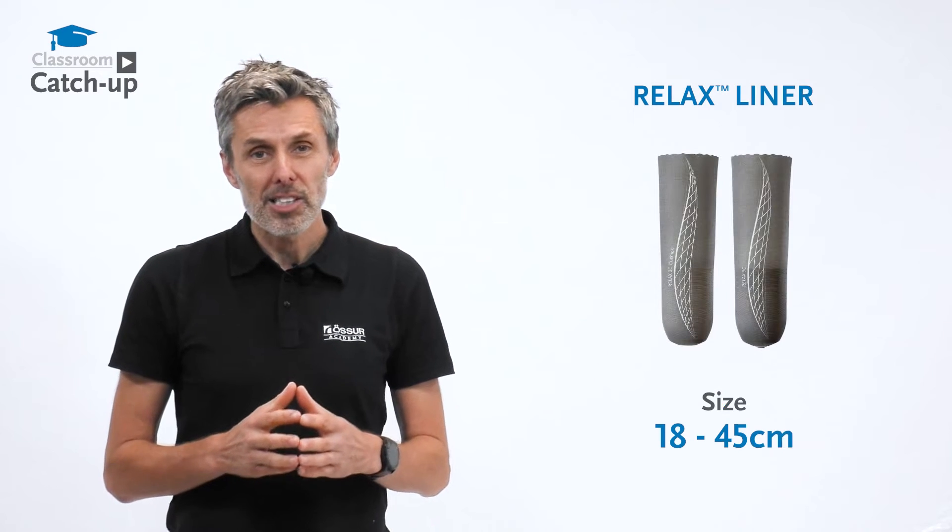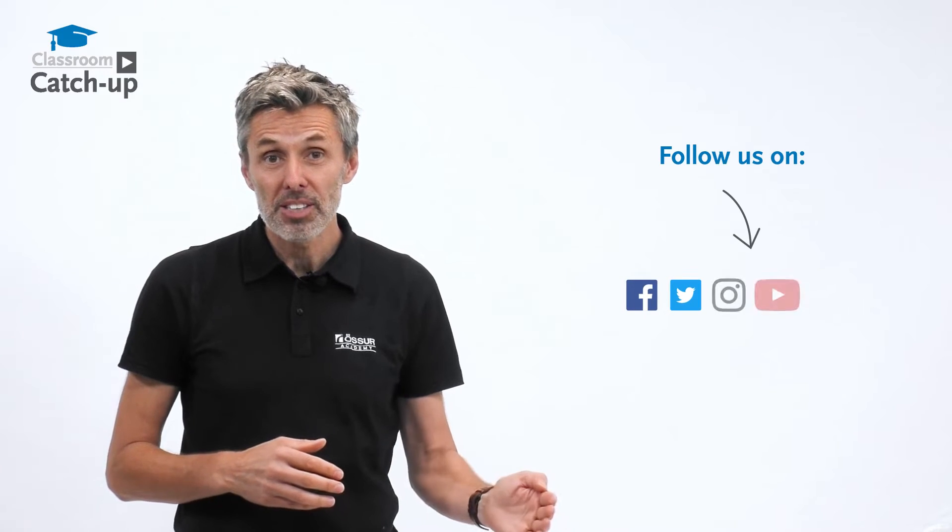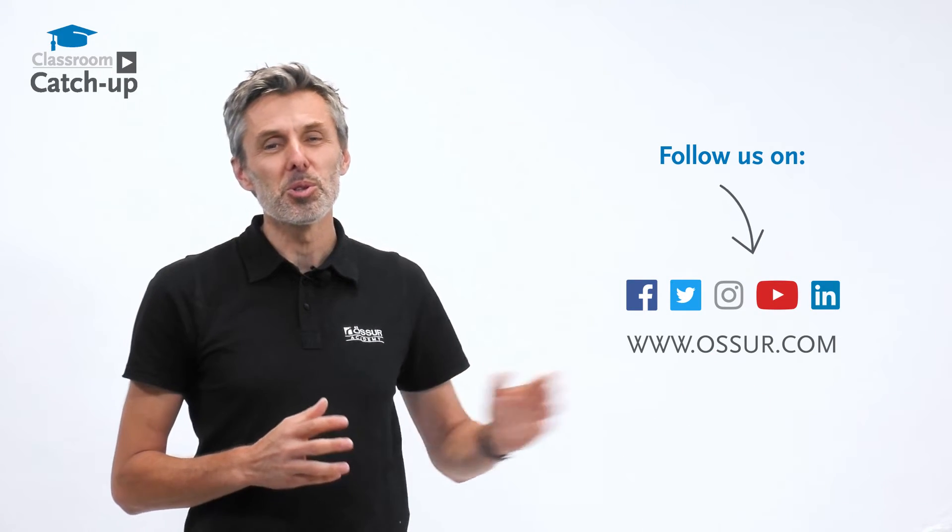The Osser Relaxed Liner comes in sizes 18 to 45 centimeters. For more information on this and other liners in our range, please contact us on the usual channels.